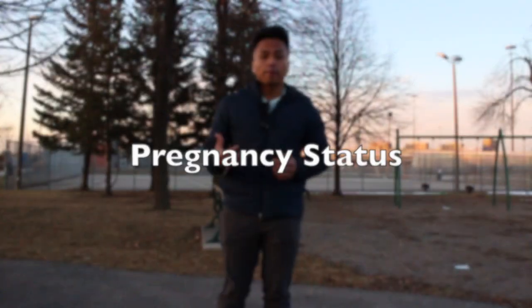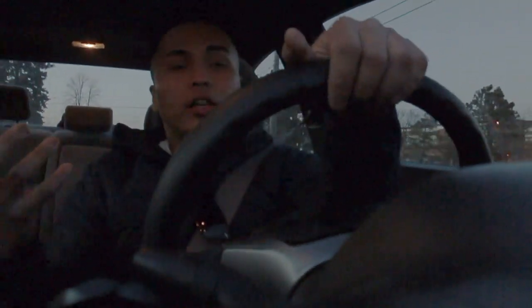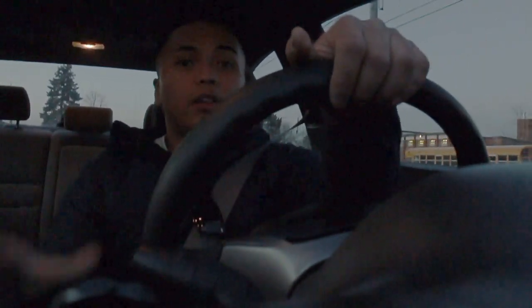We also need to keep in mind patients who are pregnant because we are using radiation for this procedure. Coagulopathy, because we are literally penetrating through the joint space and making a wound. Therefore, if your blood doesn't clot properly, that is contraindicative. Now that we have talked about indications, contraindications, and the types of things that we do in image-guided joint injections, let's talk about what exactly we need to perform these types of procedures.